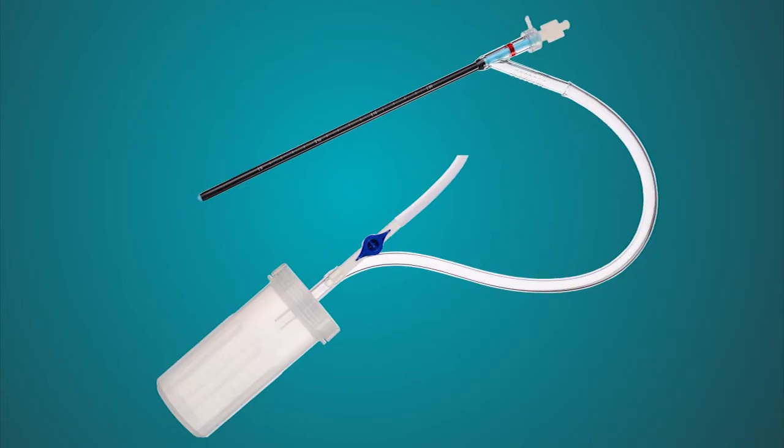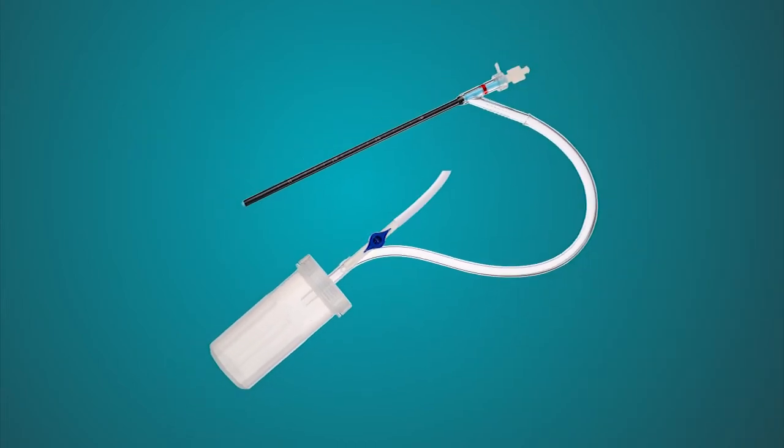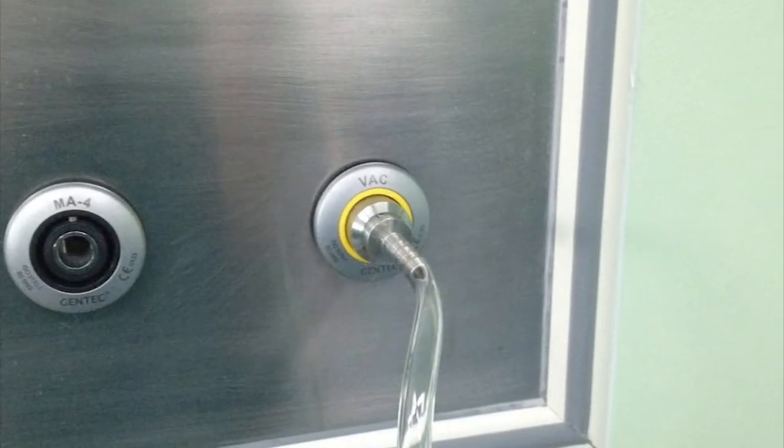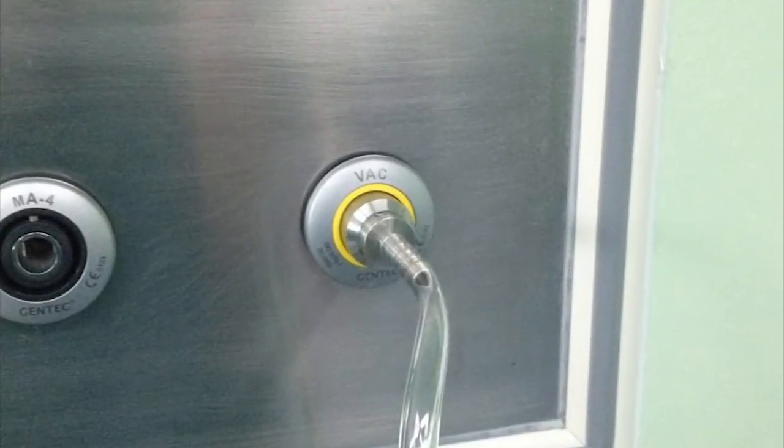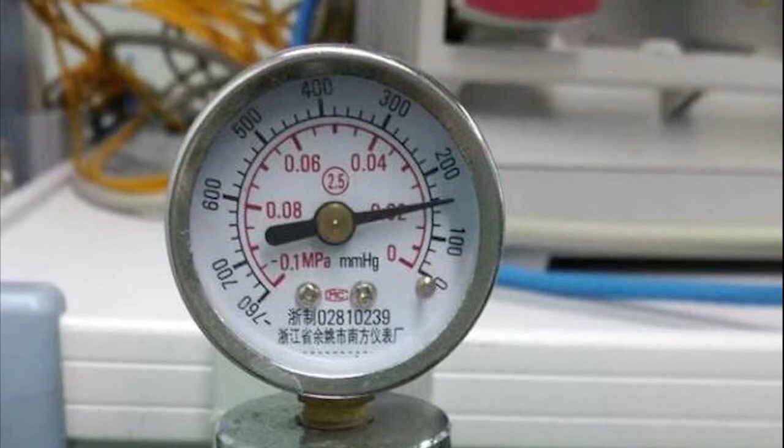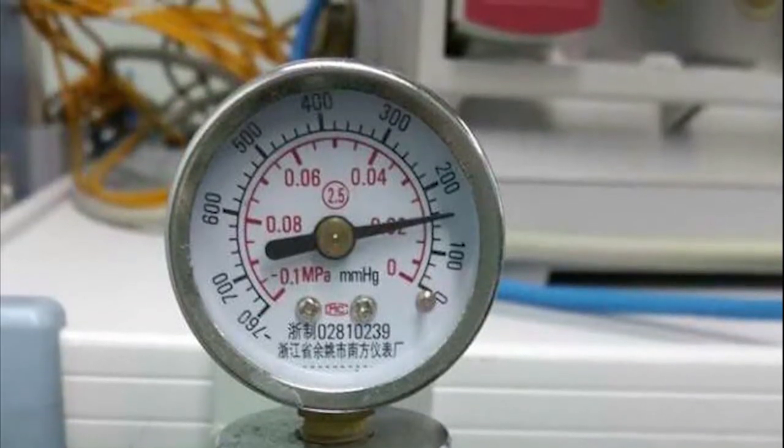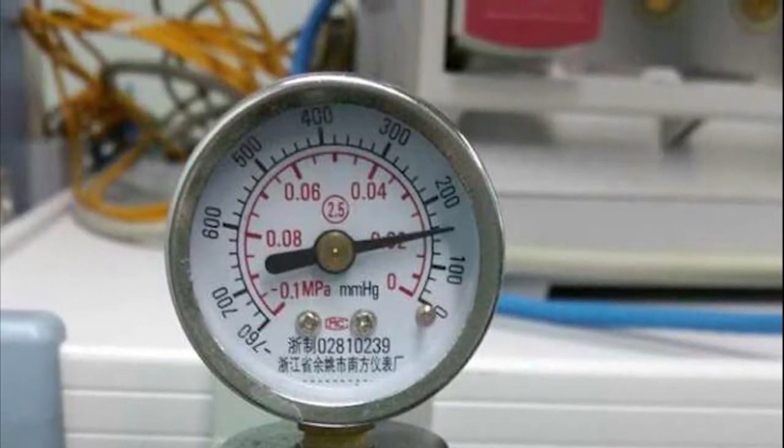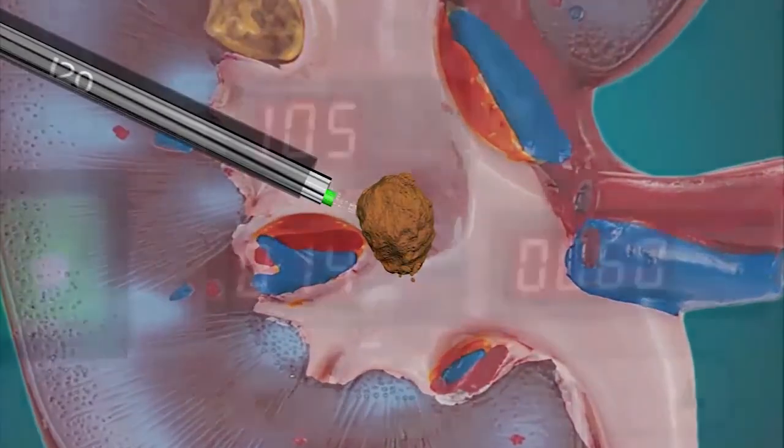Connect the oblique sluice of the access sheath to the stone collection bottle, then onto a negative pressure aspirator. Activate the suction at 150 to 200 millimeters mercury pressure. Insert the endoscope through the center aperture and turn on the pressurized irrigation at a flow of 50 to 100 cc per minute.